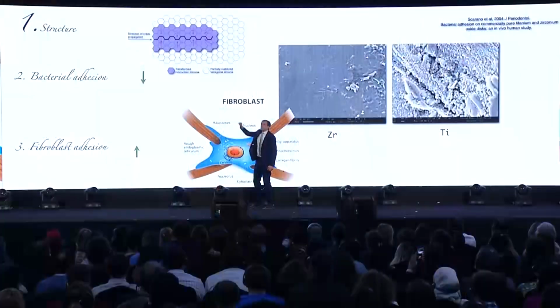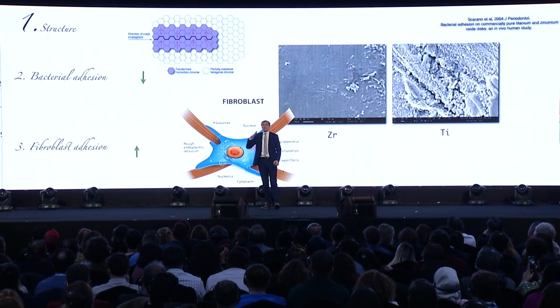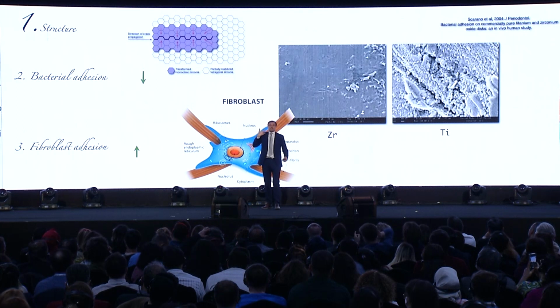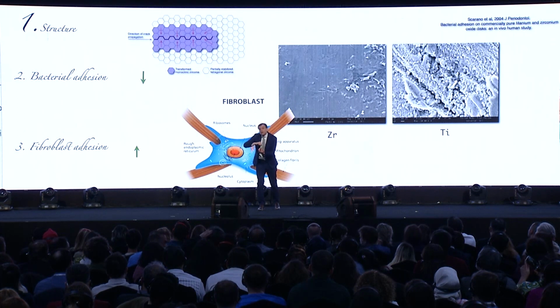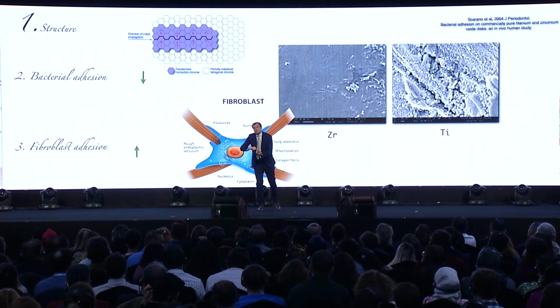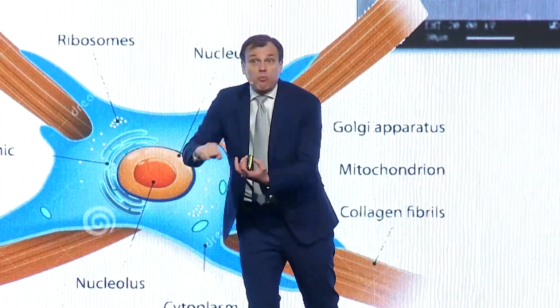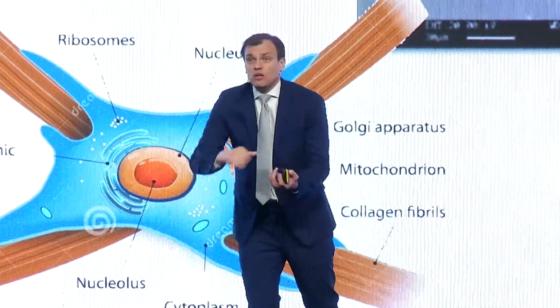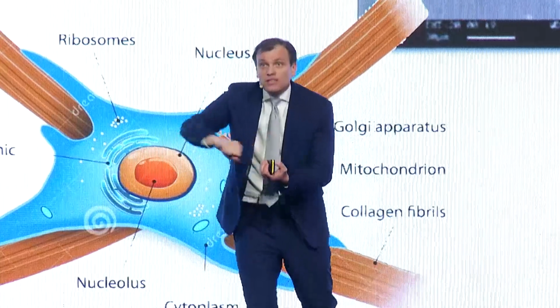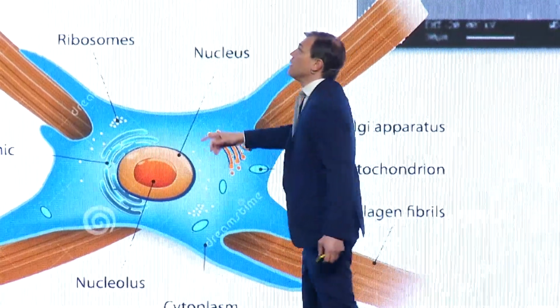I'm starting with the structure. Zirconia is very dense, but I'm not looking at it as a strong material. I'm looking from the smoothness point of view. It means that I can polish it very smoothly, because by polishing, I'm not going to open new layers. Try to polish ceramics. It's impossible. Once you think it's smooth, you suddenly open new pores and not even surface.